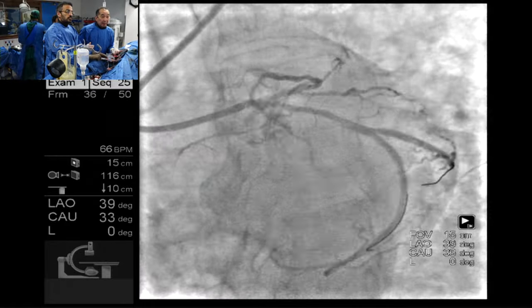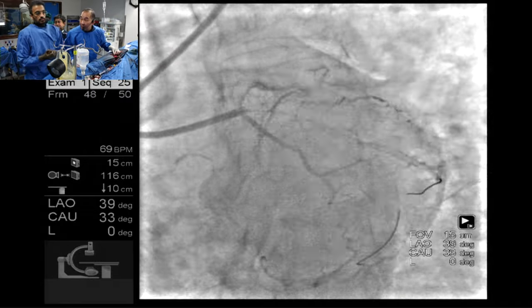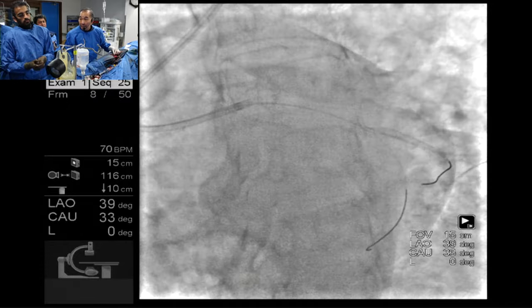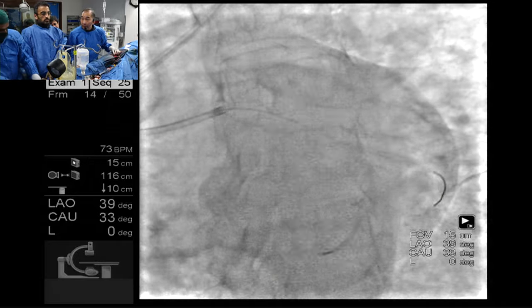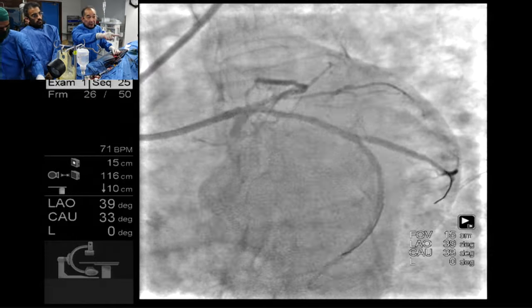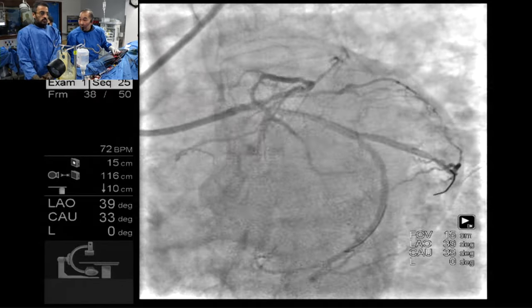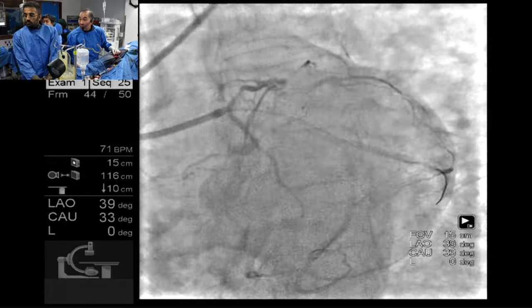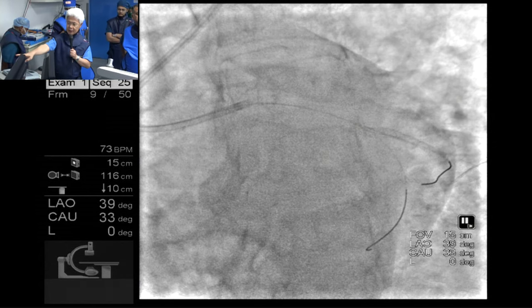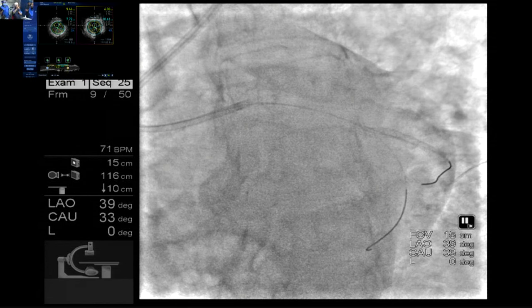What is the length of the 3.0 stent? Length is 30. And the proximal side is about 17, right? So bifurcation to the proximal end landing is about 15 to 16, up to the normal. 15 to 16 plus something distal. Distal, I don't see a lot of blockage. The distal normal portion is about 2.5 to 3, so 2.75, right? Yeah, and the length from the distal landing to the proximal landing is about 30 millimeters long. So a 30 by 3.0 stent? Yeah. Okay, can we get a 30 by 3.0 stent?